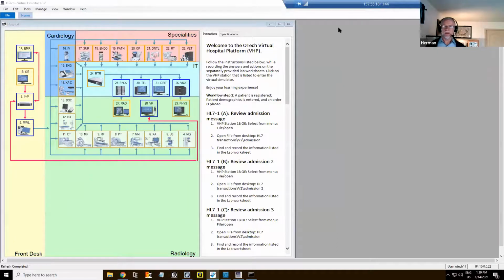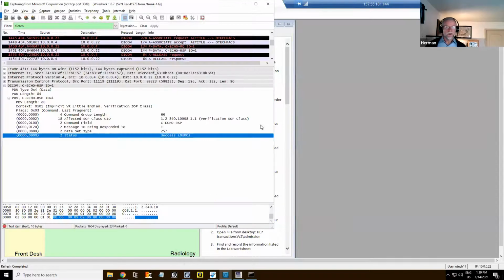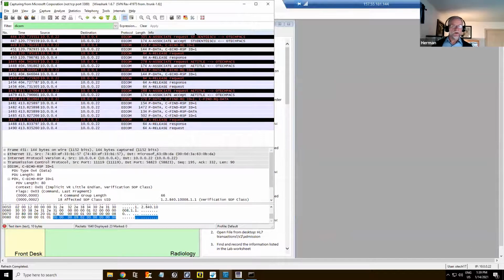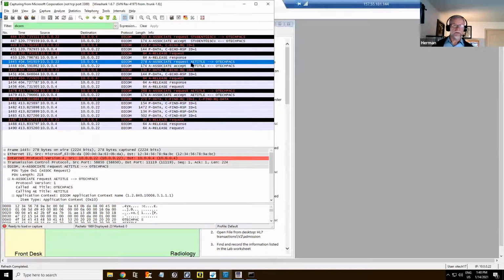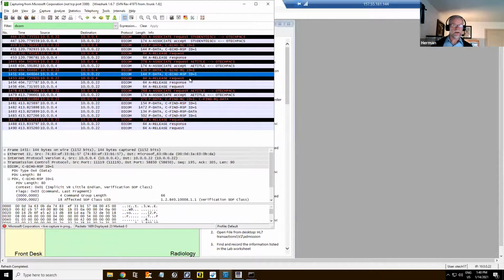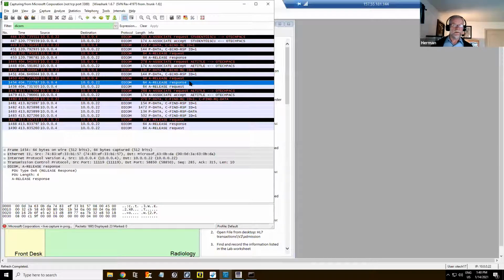Okay, what's happening over the line? What's happening over the line? Okay, so here is my first echo from a simulator. Now I have my second echo. This came from the title of my workstation. It was accepted. I did my verification. See echo request, echo response, release request, release response. Huh. Another release request.